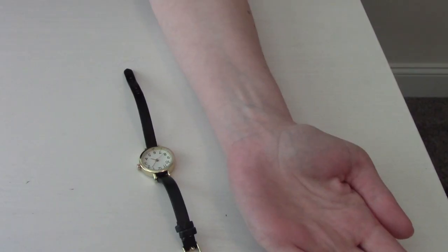Taking a temperature. There are several places you can take somebody's temperature and several different types of thermometers you could use. So for this demonstration, we just use a basic oral thermometer. So you can use this orally, axillary, rectally if you have to. There's tympanic ones, there's temporal ones. It really all depends on what you have access to. So just making sure that you're using the correct device and using it correctly on your patients.